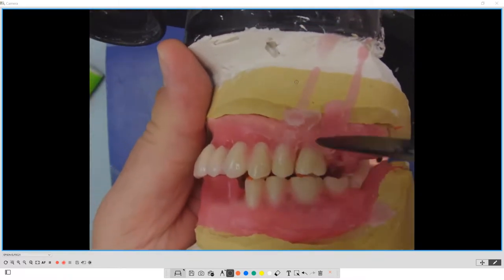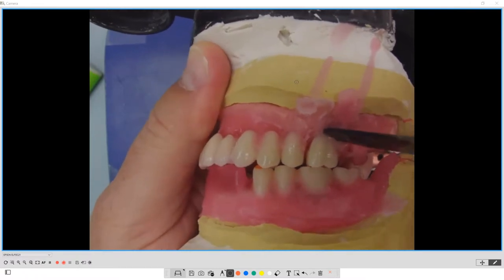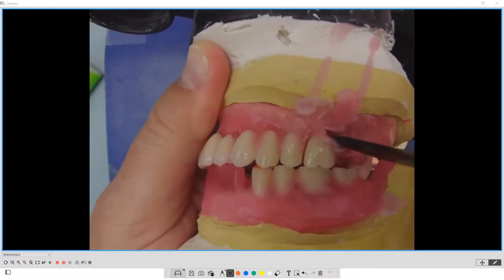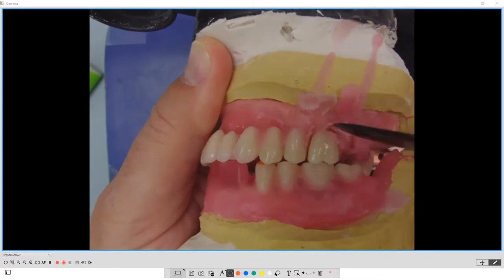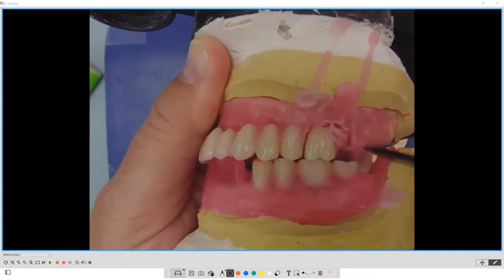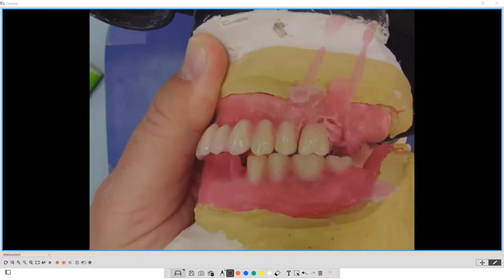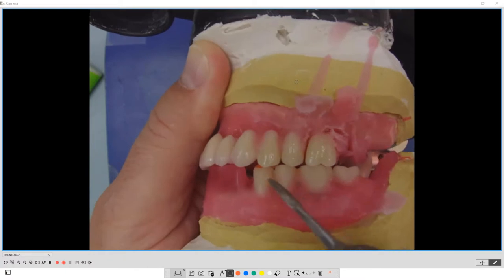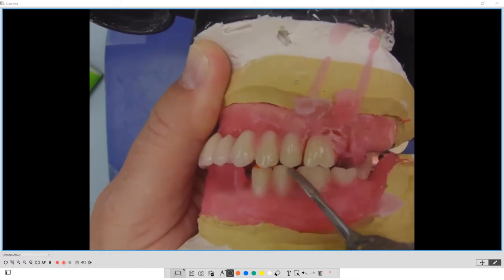what you're going to notice is, again, I can close it in, like we're a little bit more used to. See how I can close it in? And I look more like that. So this still operates in a lingualized occlusion, mortar and pestle principle, but it's not as gappy. With that said, you still are going to notice spaces here. So you still have some slight gapping.